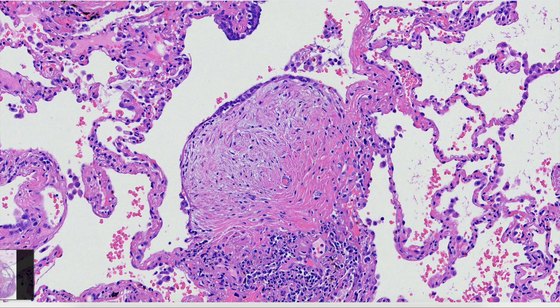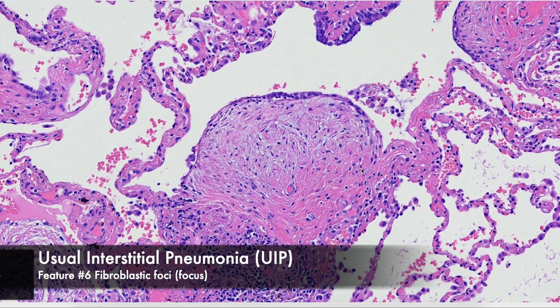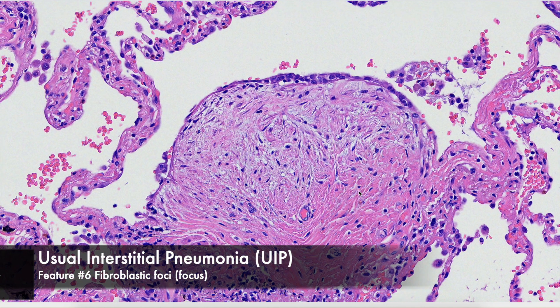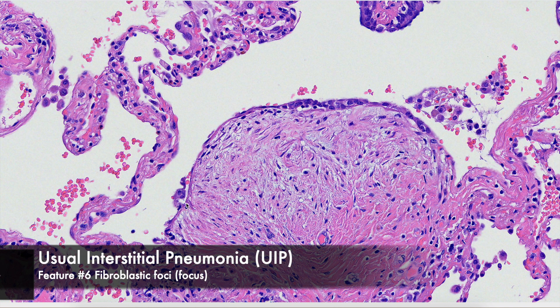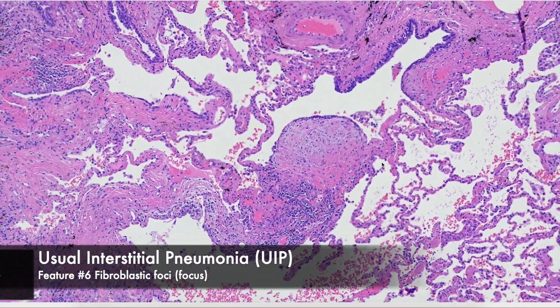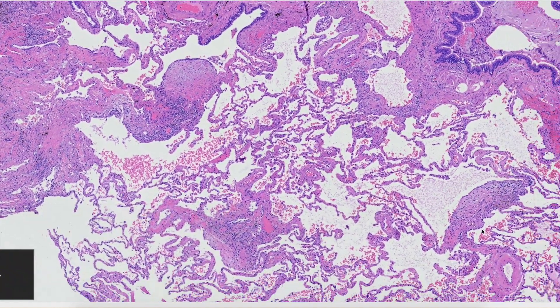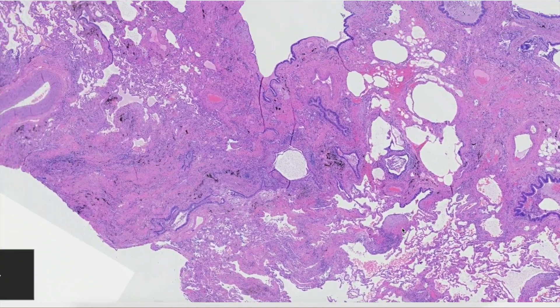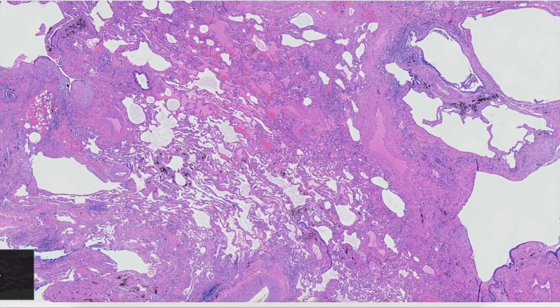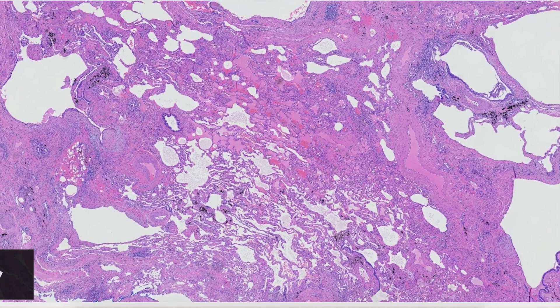Zooming into higher power, you can see a fibroblastic focus — a loose collection of fibroblasts with a grayish color, as opposed to the dark pink fibrotic areas. These tend to push into air spaces and can have metaplastic epithelium overlying them. At lower power, you can see multiple fibroblastic foci as loose, grayish areas within the dense fibrosis.